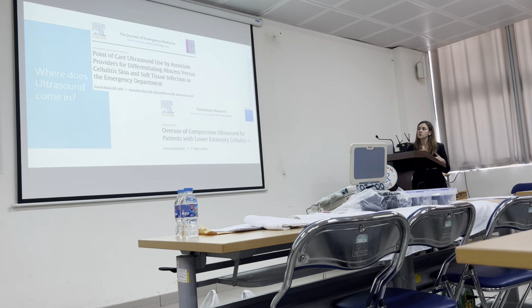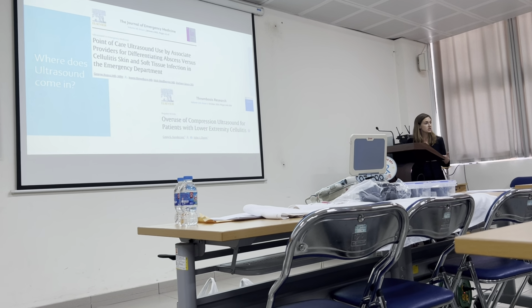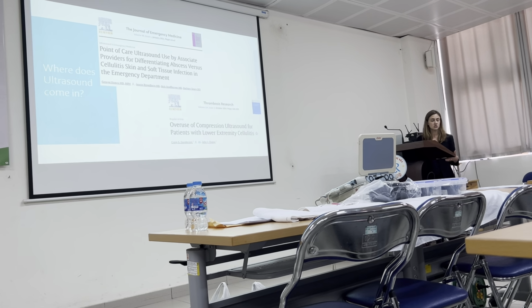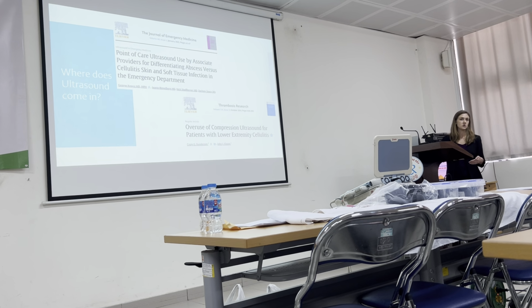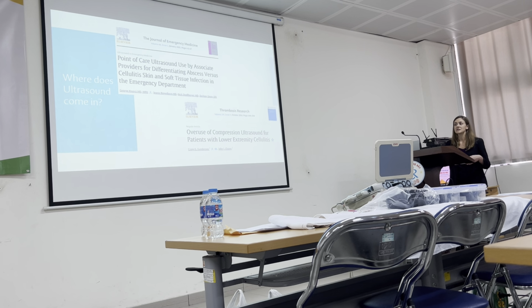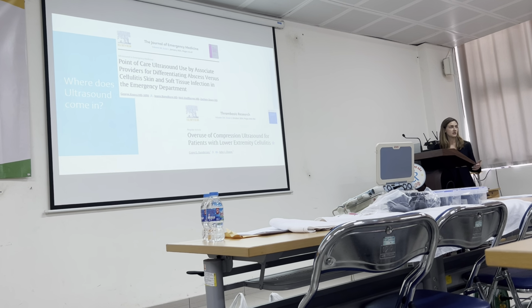You can see when some of these are used that if you can identify the abscess and how large it is, you can either save the patient from having to undergo an incision and drainage by using a needle aspiration, or if they don't need either of those procedures, this is something that you can watch and wait. However, this also showed that there is an overuse of ultrasound for patients with lower extremity cellulitis.